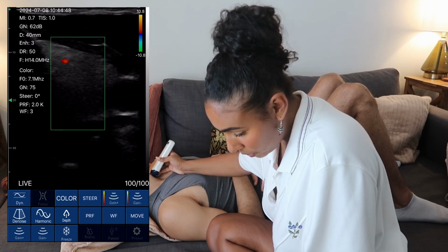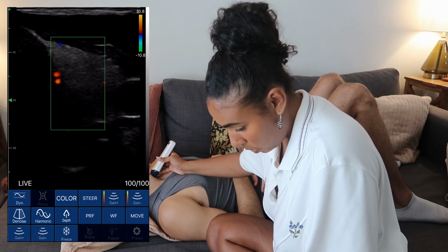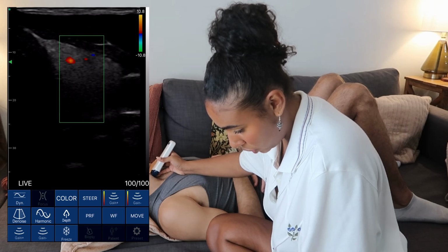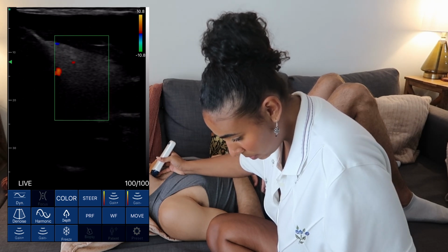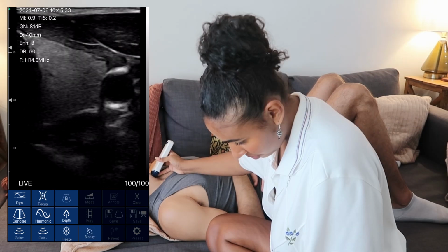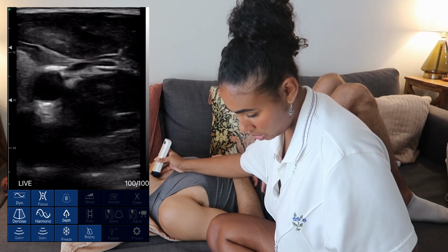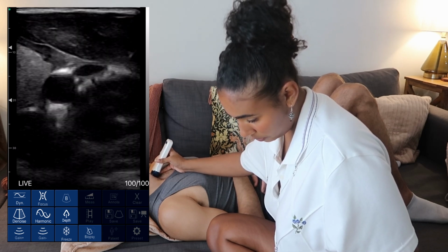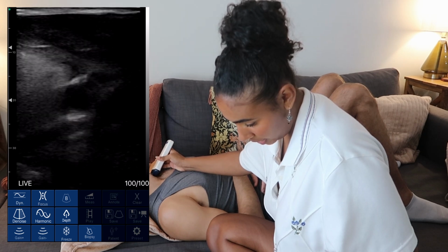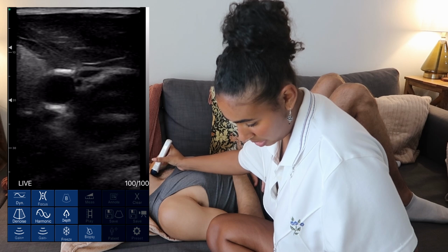Okay, so I decreased our depth so we could focus on his left lobe, and I made our color box as big as I could, which I just did with my fingers. Here, I'll show you. In and out, just touch screen it. And then I put some color on so that we can see the flow and the vascularity going into his thyroid. And then I increased the gain as well. So now if we go over to his left carotid and jugular, again, we can see that the jugular collapses much easier when I put any pressure on it.